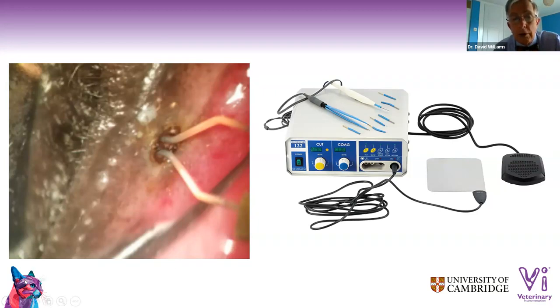as you can see here, the meibomian gland orifices here. Okay. And so what we've done there is to fry the gland of one of these where there's been a hair coming out.